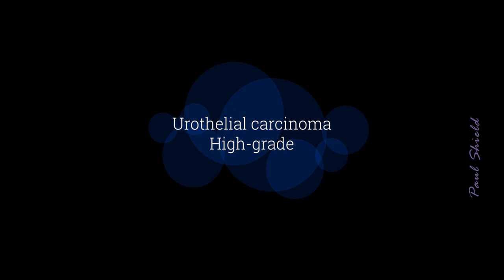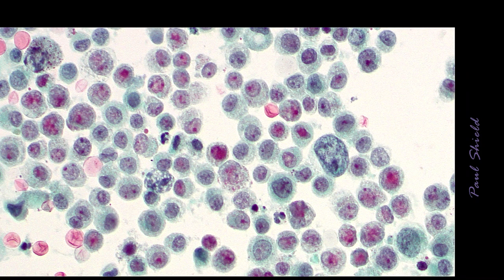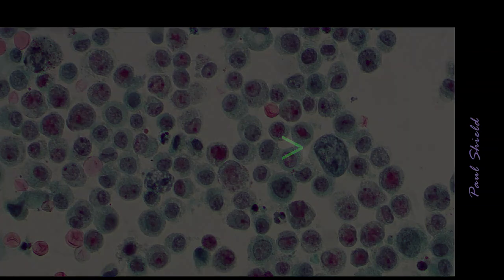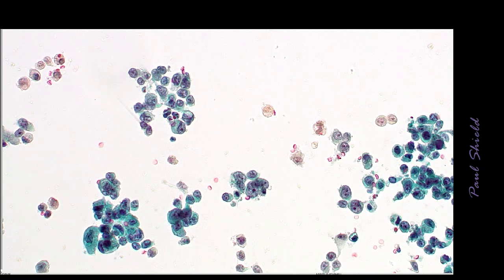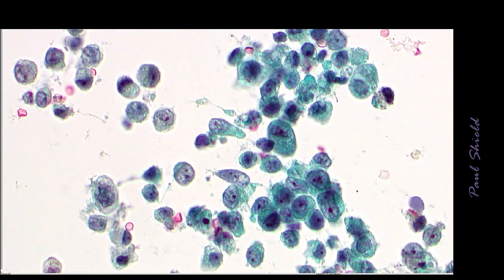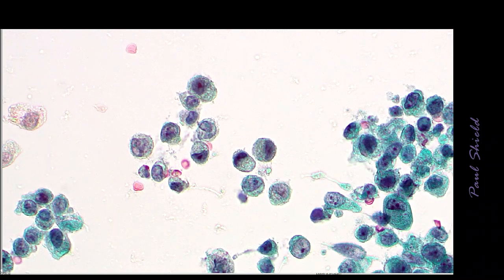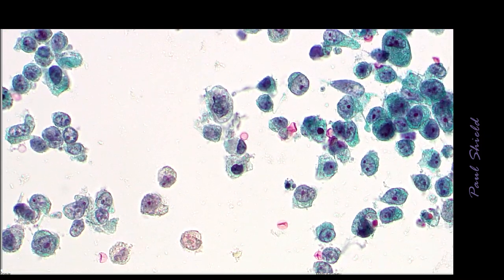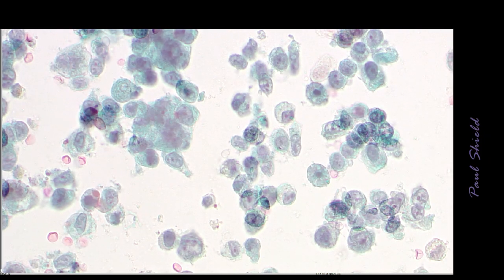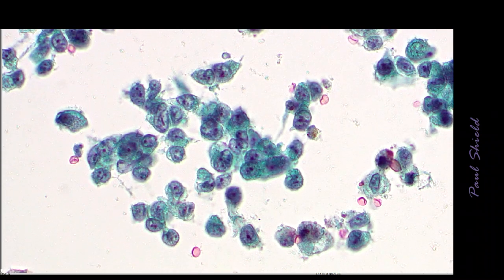This is the focus of urine cytology, and this is a typical high grade field. There is quite a bit of degeneration in some of these cells here, but we've got as well some really obvious malignant looking nuclear chromatin. Here you can see very high NC ratio cells, kind of coarse chromatin. Some mostly round, but some irregularities of the nuclear membrane. And when they're well preserved, they'll have quite prominent nucleoli. But very high NC, so these are like, I suppose, the same NC ratio as a high SIL cell.